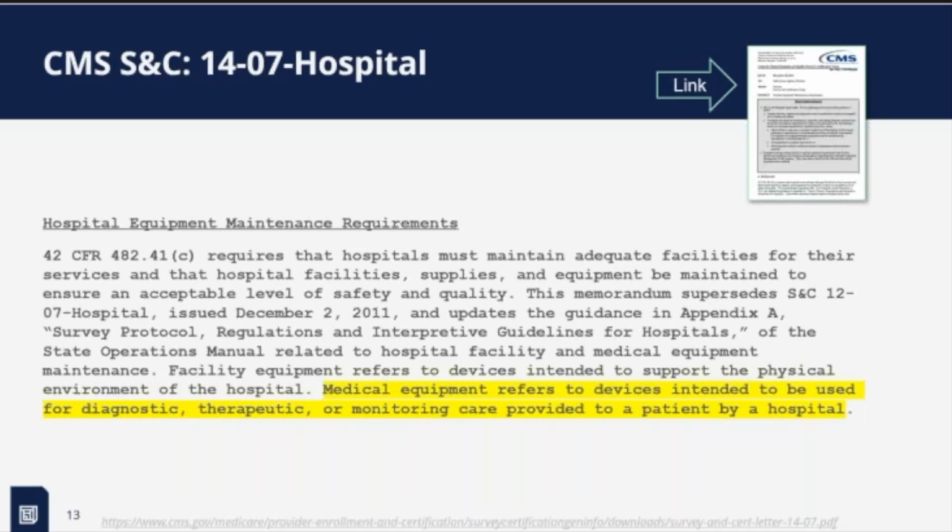Even in the language, they're trying to be a little bit more defined in what they're talking about. It all starts here, and whether you're DNV or Joint Commission, they write their specifications towards CMS. They're ultimately governed by CMS. CMS checks up on them. That's one of the reasons for the Joint Commission changes, from my understanding, from the hearsay out there in the industry: Joint Commission went far beyond what CMS was requiring, in other areas, not just biomedical.